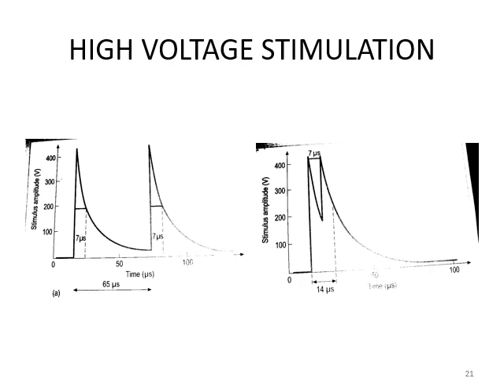In the second version, on the right side, you can see that as the intensity reaches peak and drops down within 7 microseconds to half, again the second peak comes, followed by gradual decline for again 7 microseconds.